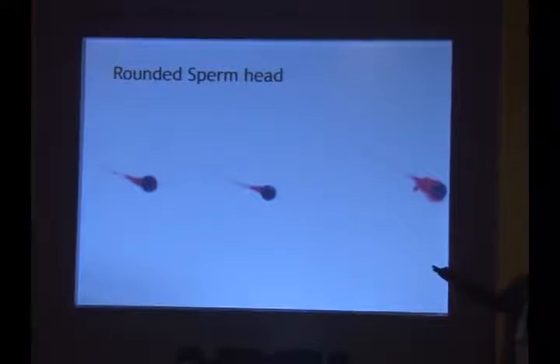All you need to do is, they are motile sperm, they are live. There is DNA content in the sperm head. So I pick up the sperm and inject it into the egg by micromanipulator and you will see pregnancies.